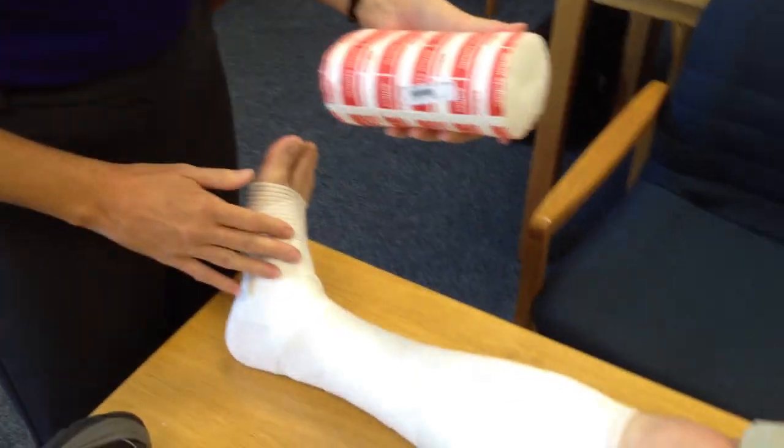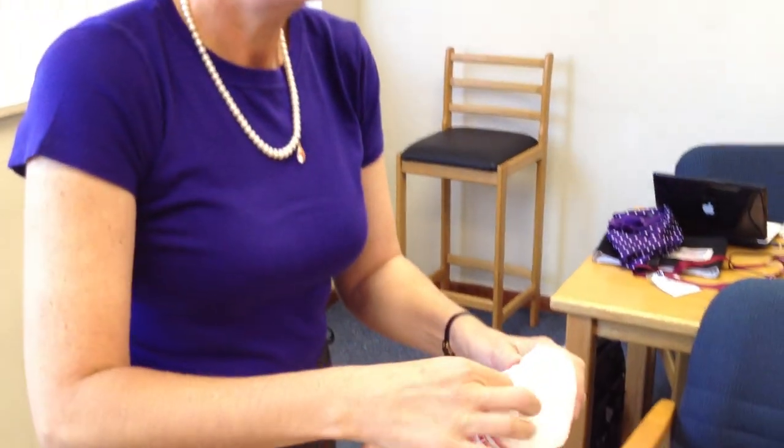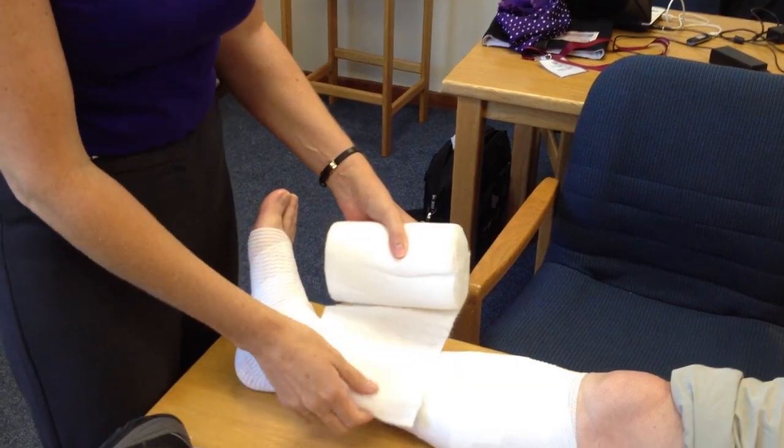Notice that I have put the bandage on first. This is different from literature where the orthopedic wool would go onto the skin first. What's found in practice is that slipping of this bandage system is much less if we sandwich the roll of orthopedic wool in between the two layers. The actual role of the wool is to absorb extra moisture and wick it away from the skin. It gives a conforming layer, and with the orthopedic wool not next to the skin it's not going to be as warm in a hot weather climate. We have found that patients can adhere to this system very easily because of the wicking away of sweat, moisture, and exudate from the skin.